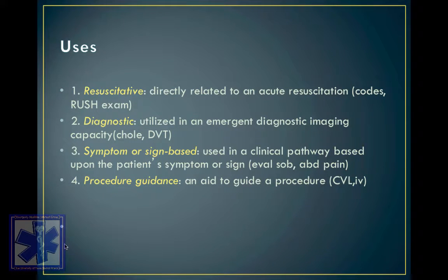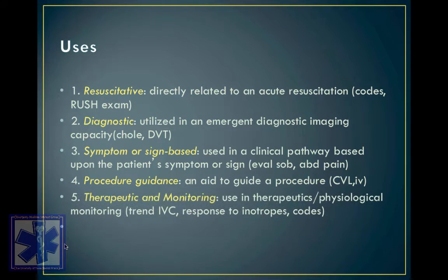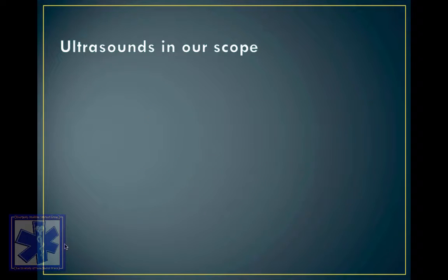Using it for procedure guidance, which is probably, I'd say, 50% or more of what we do using ultrasound in the ED. And then therapeutics and monitoring. You can trend IVCs, the response to fluids and pressors, and go from there.